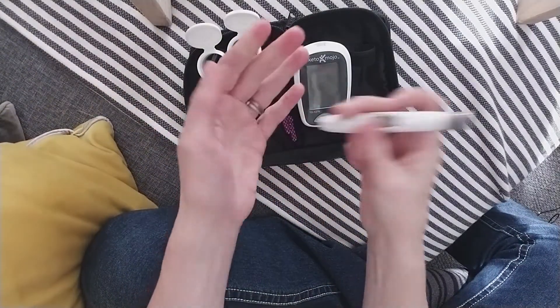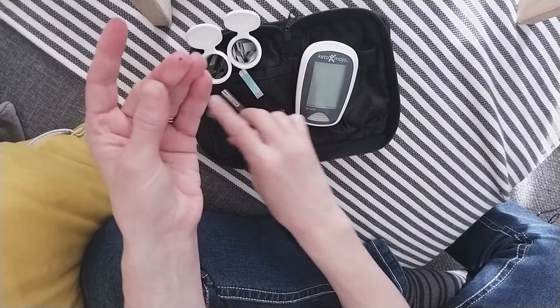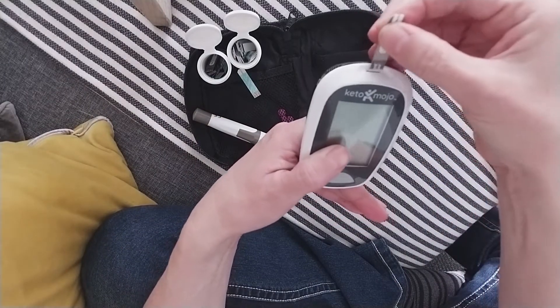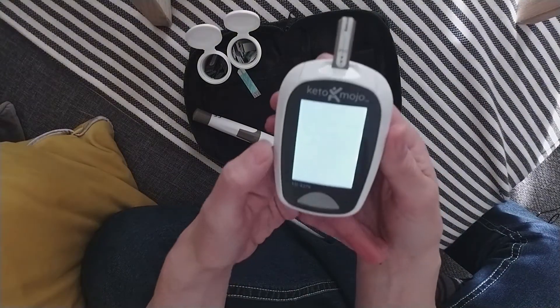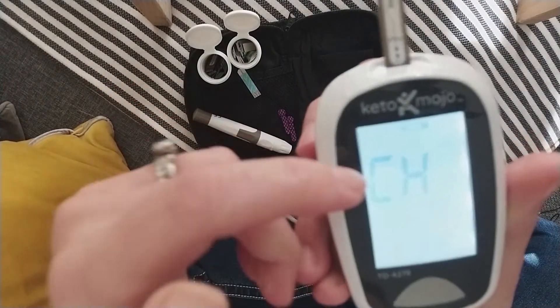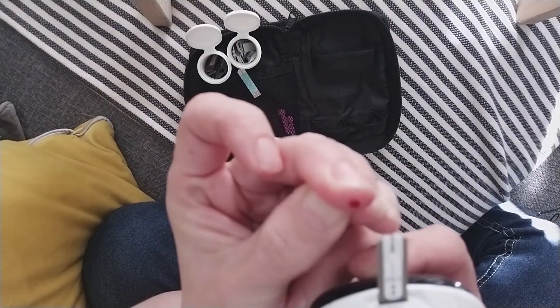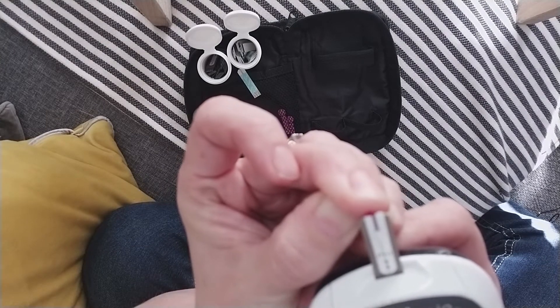You also need your glucose strips and your ketone test strips. I'm going to start by pricking my finger with the provided lancet just to get a little droplet of blood, and then inserting the glucose strip into the monitor. Once you see the little blood droplet icon on the screen, it's time to touch the tip of the strip to your blood drop.